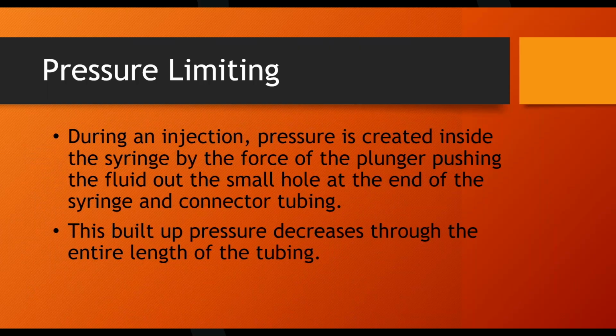So let's say we're going to do an injection into a patient. Everybody understands what flow rate and volume is, I assume. If you don't, let me know. Pressure limit. This is an important concept, but it's a very misunderstood concept by even the techs sometimes. The pressure limit is how much pressure, and we talk in PSI, will we allow to build up in the syringe during the actual injection? And that's the important part that's misunderstood. The pressure limit is the pressure in the syringe, not the patient.